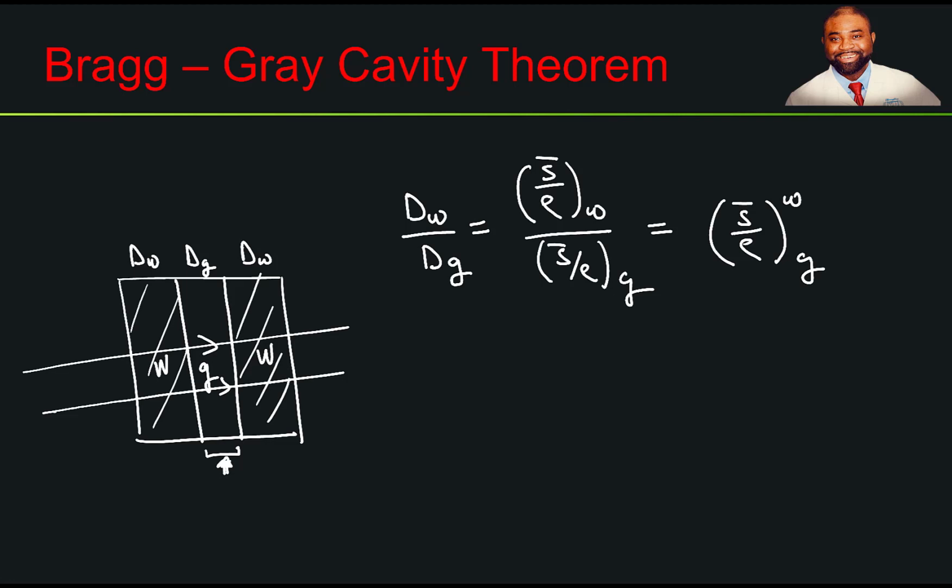Keep in mind that this represents the unrestricted mass collision stopping power averaged over the spectrum of the primary electrons entering that particular partition.